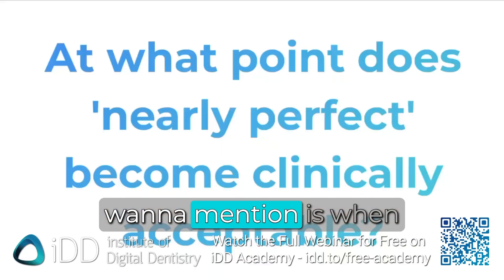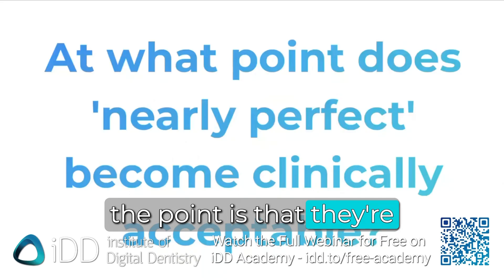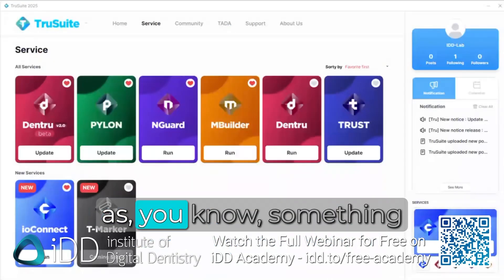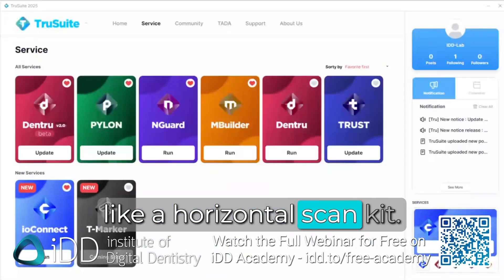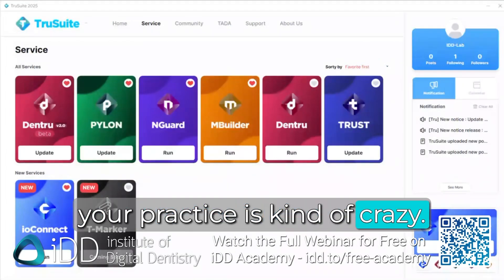When does nearly perfect become clinically acceptable? The point is that photogrammetry units are never going to get as cheap as a horizontal scan kit. Getting the IO Connect for $5,000 and unlocking this capability in your practice is kind of crazy value.